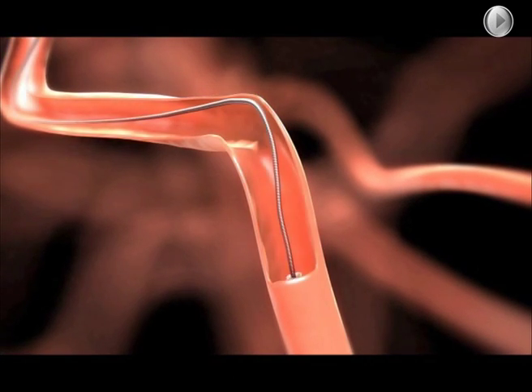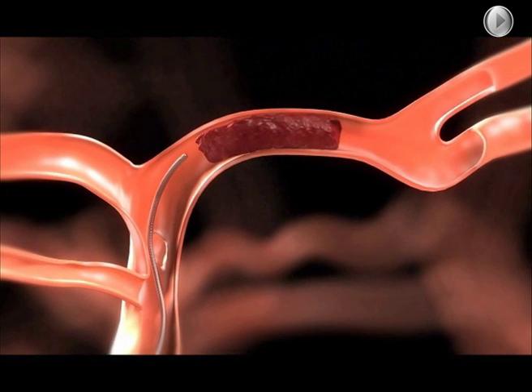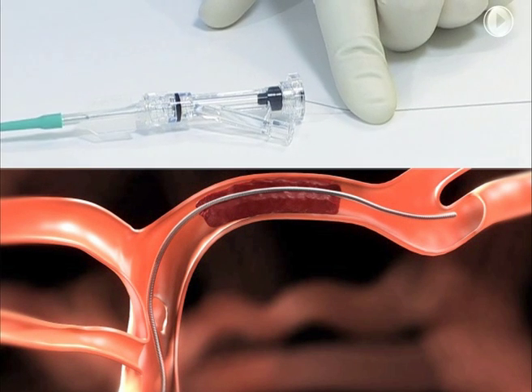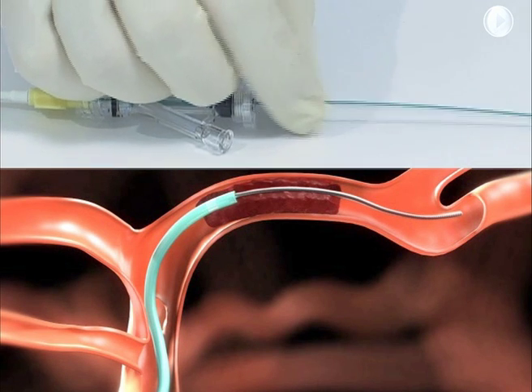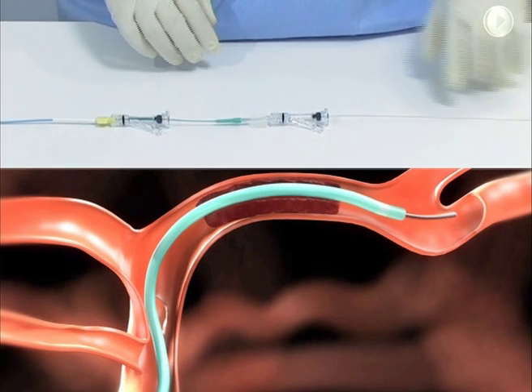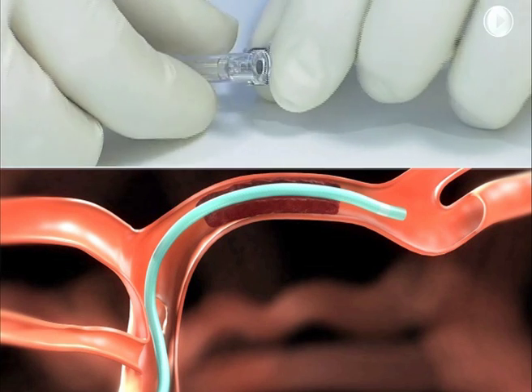Position the balloon guide catheter as close to the thrombus site as possible. Connect a rotating hemostatic valve (RHV) to the fitting of the guide catheter and then connect the continuous flush. With the aid of a suitable guide wire, hold the guide wire in place and advance the micro catheter. Position the micro catheter distal to the thrombus so that the usable length portion of the Solitaire FR will extend past each side of the thrombus when fully deployed. Once the micro catheter is in place, remove the guide wire and tighten the RHV to secure the catheter.